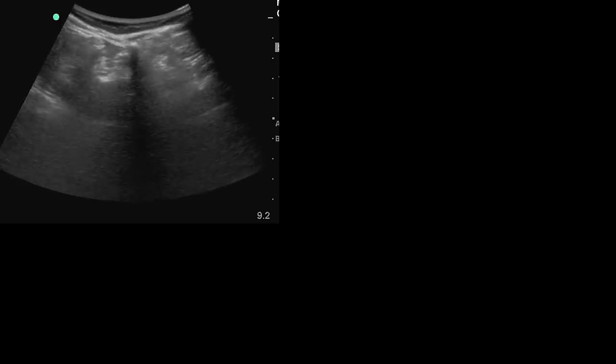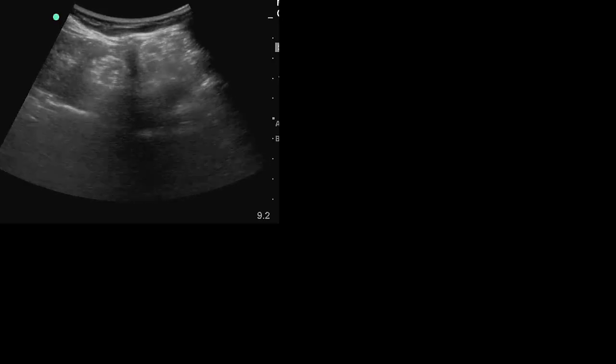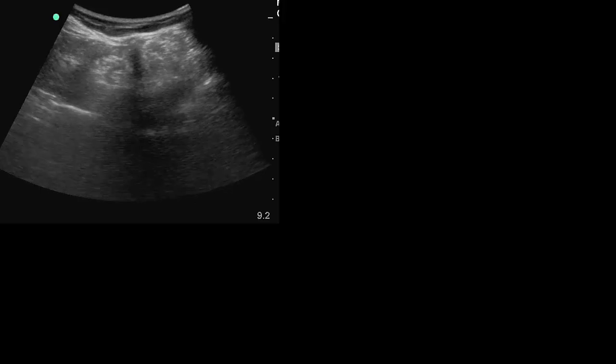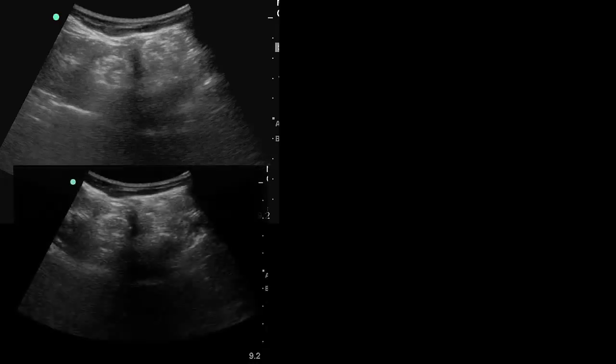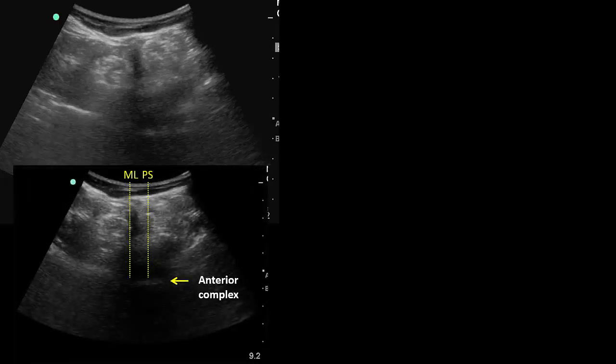Our third patient also had a significant degree of lumbar scoliosis. The parasagittal oblique scan was done in the usual fashion to count levels and to assess the width of spaces as described earlier. As the video of the transverse scan shows, there is a significant rotational element to her curve. This is brought into the vertical by appropriate rotation and angling of the probe. The probe is slid cranially and caudally to locate an anterior complex, which signifies an open window into the canal. Like our second patient, the anterior complex is visible lateral to the spinous process shadow of the midline, and can be accessed by a paraspinous approach.